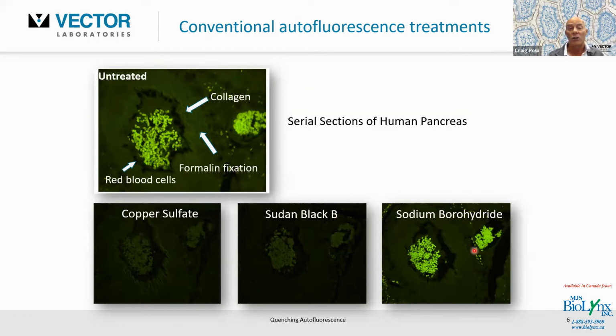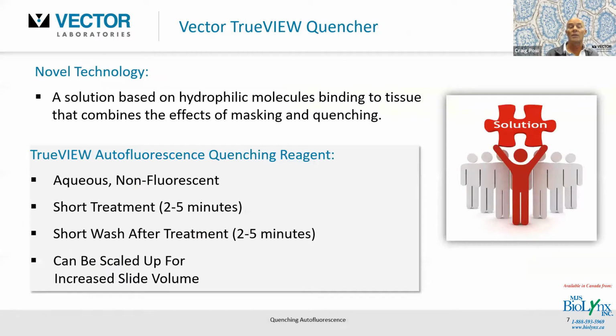And the sodium borohydride, dreadful to make up, as I mentioned, and really does nothing to quench the autofluorescence from these red blood cells. All right, so some of you may have tried those and experienced some of these phenomena as well. They're not really effective, even though they have been published on by some investigators. So let me introduce you to something called our Vector TrueView autofluorescence quenching reagent. As I've listed there, it's a novel technology, solution based on hydrophilic molecules that bind to the tissue and greatly reduce background autofluorescence.